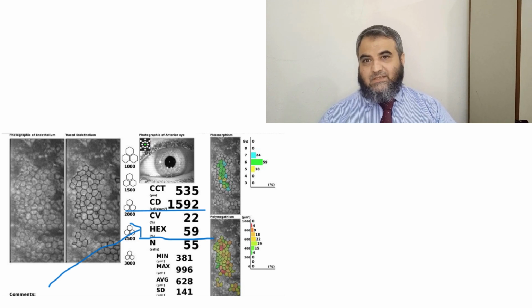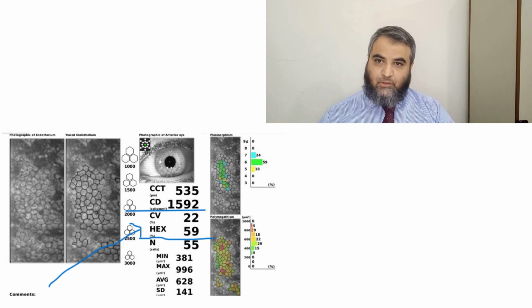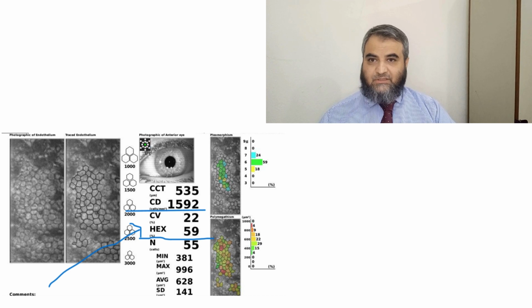I know these things add to the ultimate cost of the surgery, but if you consider it in a broad perspective, you will see that the decision making and the later complications can be anticipated earlier if we do these tests before the surgery. It is our routine practice to do it in all patients, with endothelial cell count documented.